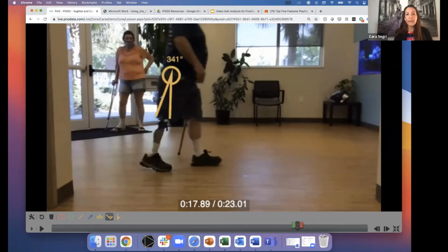I don't like that, so I go back and do the other angle. So he's right around 14, 15 degrees there.